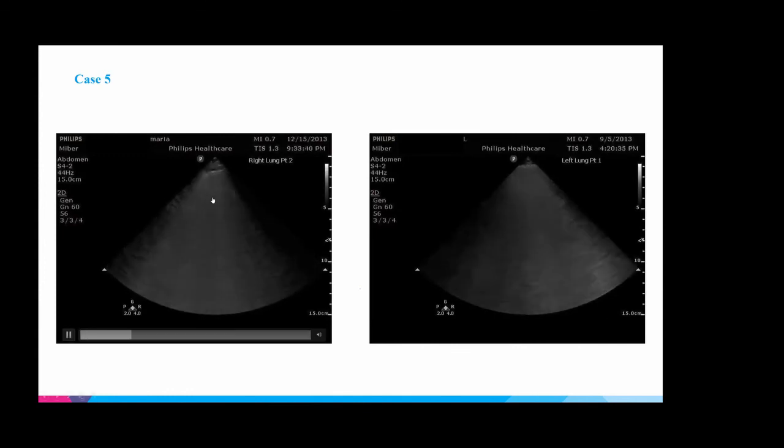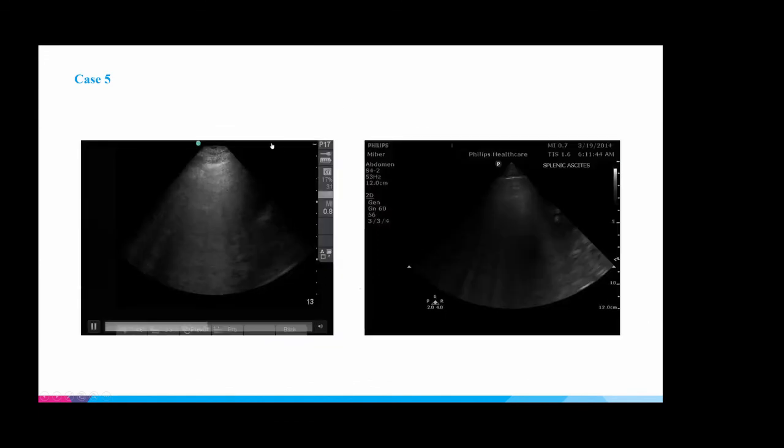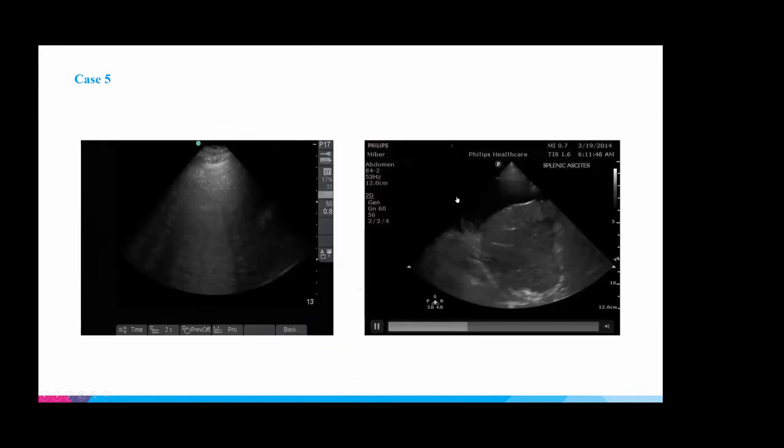Yeah, I mean, they really go the extent of the way down, almost like the bottle rocket sign, right? So where you get pretty diffuse, confluent B lines, you can't even really count how many B lines there are. So definitely in the anterior lung fields, it's confluent B lines. And then we looked at the bases as well.